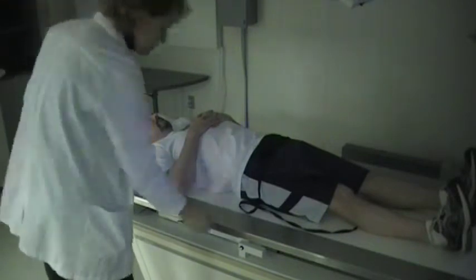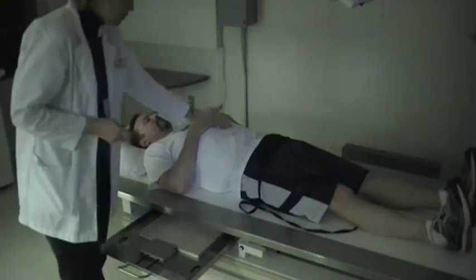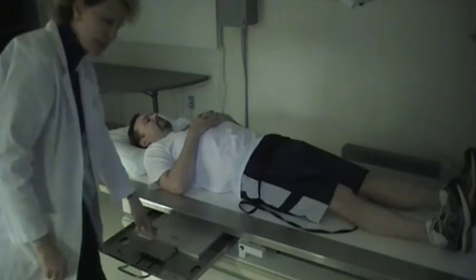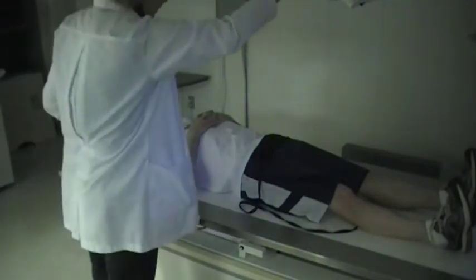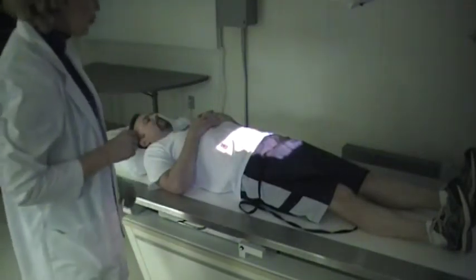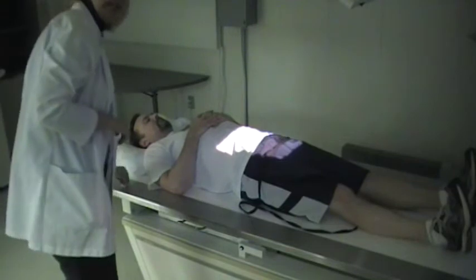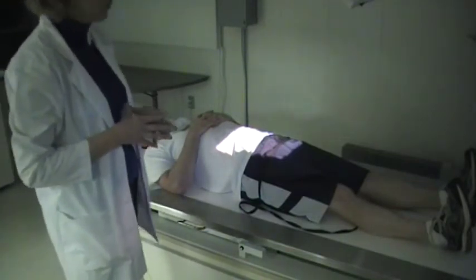Once you have your tube in position, remember to check your bucky. Since this is the right side of the patient, you can either put your right marker directly on the image receptor — I'm using the smaller image receptor — or if it's a DR system, you can place it just on the right side of the patient. This is for the AP axial of the sacroiliac joint, and it also shows the L5-S1 joint space really well.